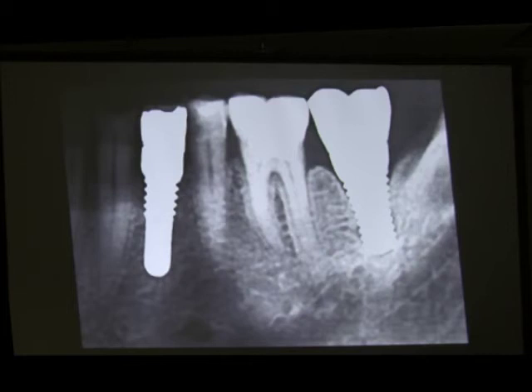But we have seen that gum doesn't grow as much when we put temporaries. And it's true that some patients don't want temporaries. It's not just the US, it's everywhere. People sometimes cannot go with temporaries if they have meetings or photography sessions. But it's important to put in place that 4 months after, if there is an aesthetic complaint, you have to have the protocol in a way so that you did everything that is successful. And when you put a crown, you always have less soft tissue creeping. The thinner the periodontal tissue is, the more risky it is that you end up having recession.